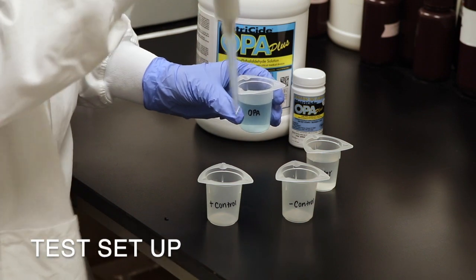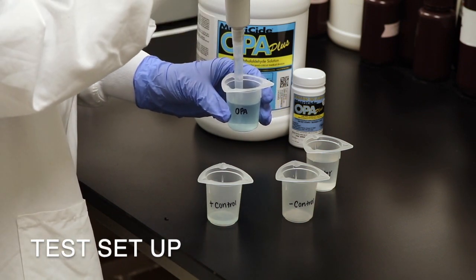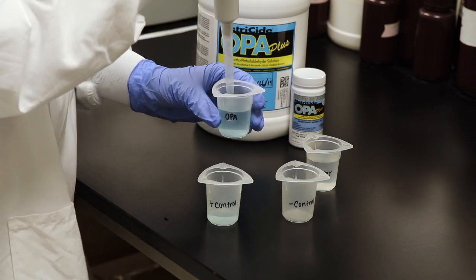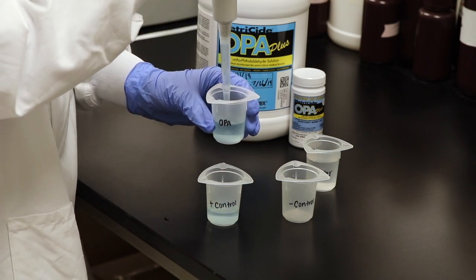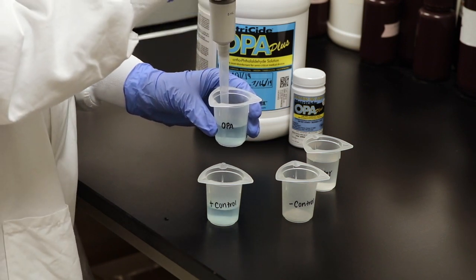Begin by preparing the positive control and negative control solutions. The positive control will require 25 milliliters of undiluted Metricide OPA. The negative control will require 10 milliliters of undiluted Metricide OPA Plus and 15 milliliters of potable water. Be sure to mix the negative control solution well.